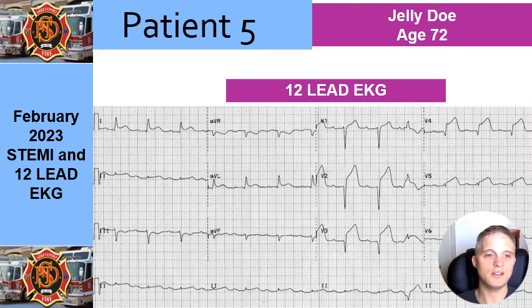So the 12 lead, on the other hand, we look: rate, rhythm, P, QRS, T, and ST. Man, first thing that blows my mind, 1, AVL, V5, V6, but man, look at this. We got V1 through V4. So we do have some reciprocal changes in our inferior leads. Again, this is an anterior lateral STEMI. How do we know it's anterior? Because it's 1 through 4. How do we know it's lateral? 1, AVL, V5, and V6.